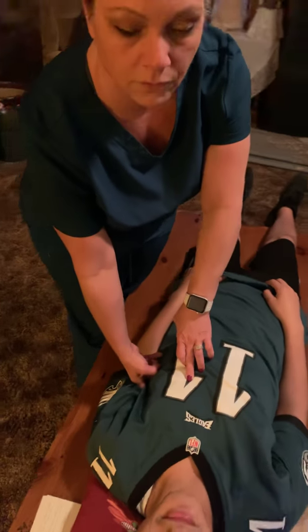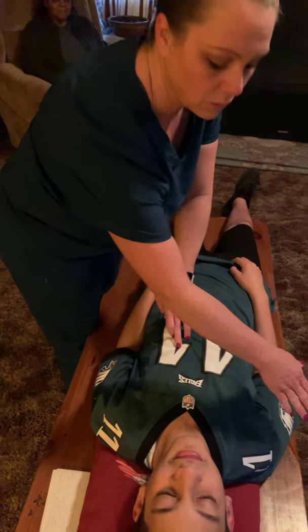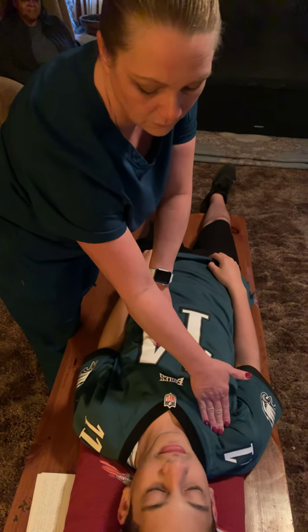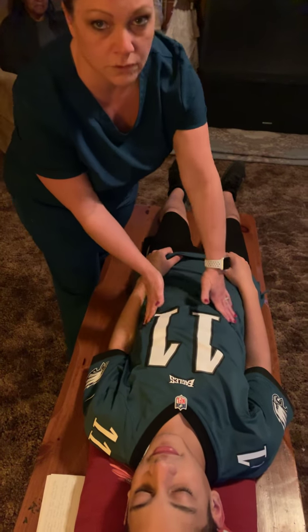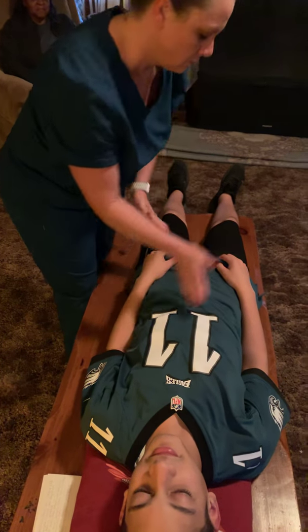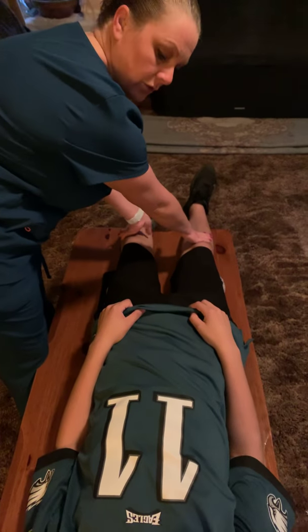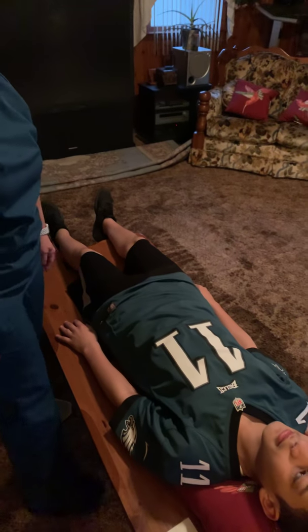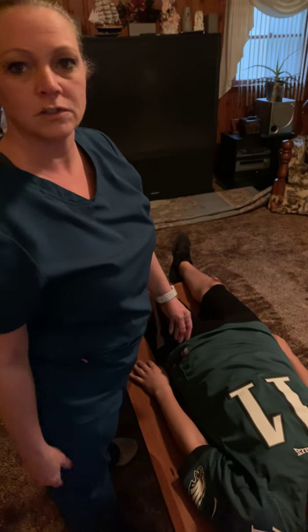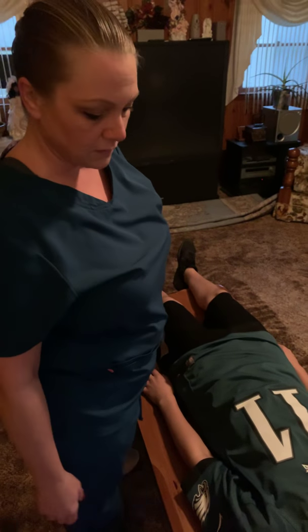Then you have your 4 limb leads, which will be your right arm. You could also do right arm here. Left arm here. You could also do your legs here on your belly. But you'll have your right leg and your left leg. And you'll have the patient rest his arms down, take a deep breath, and try to relax as much as possible. It's a 3-second, maybe 4-second test, as long as you can get the patient to relax. And this is very hard when you're short of breath, chest is hurting. So you'll run your test.